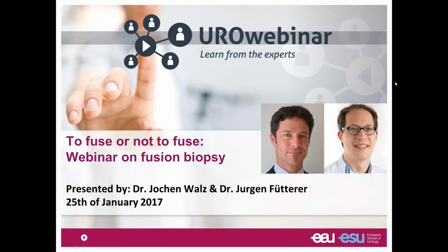And most of the fusion systems we have available currently that do it transperineally have a nice way to register and show where the biopsies were taken, where they might have been positive afterwards, to give you a sort of cartography, a map of the cancer inside of the prostate, which is then of course interesting for any treatment you're planning afterwards. And there's always also discussion about the sepsis rate, transrectal versus transperineal. So yeah.